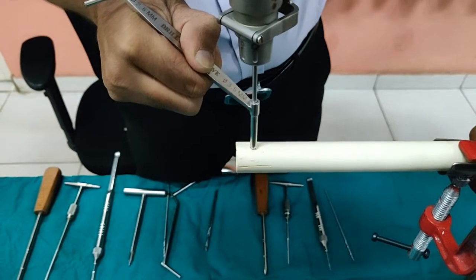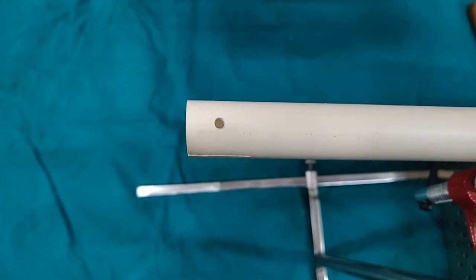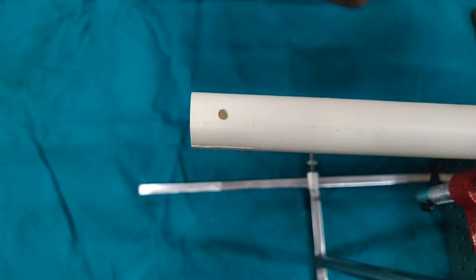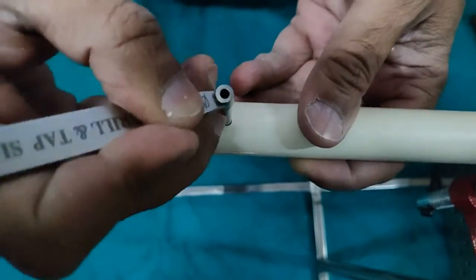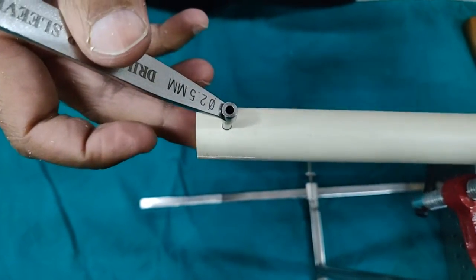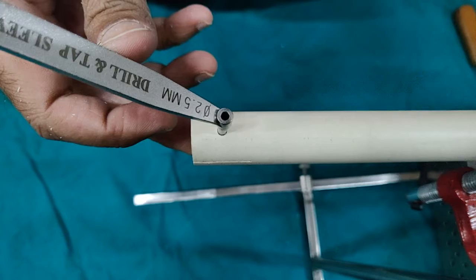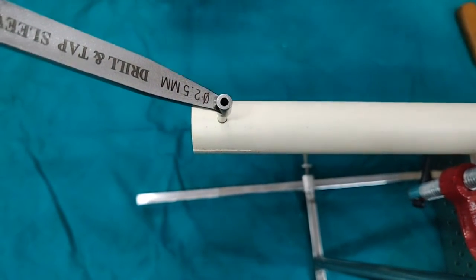The first cortex is now done — this is our gliding hole. Once you have done the gliding hole, you can do the pilot hole. The other part of the sleeve will actually go inside the gliding hole very easily, and this will help you put the screw in the right direction. That is why I always advise putting the gliding hole first — then the pilot hole. Next step is to put the pilot hole using a 2.5mm drill bit.